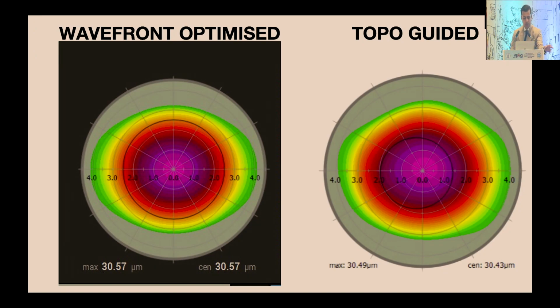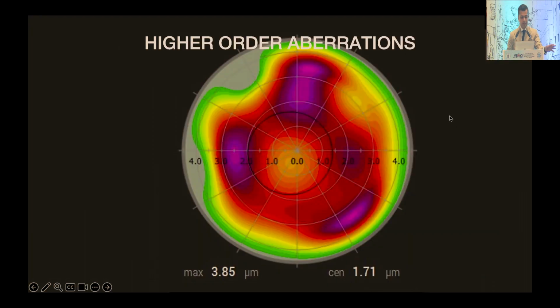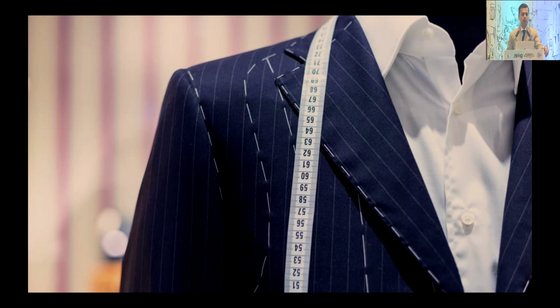So in this same patient, if you notice, this was the treatment. If I were to do a simple LASIK or a lenticule or whatnot, it would be an optimized treatment. Versus if I do a topo-guided treatment, the difference is this. Apart from removing the numbers, it's also going to shave your cornea in certain places a little more and a little less, so as to make an irregular cornea regular. Even in a regular, normal, pristine virgin eye, it will make it better so that your vision becomes better.